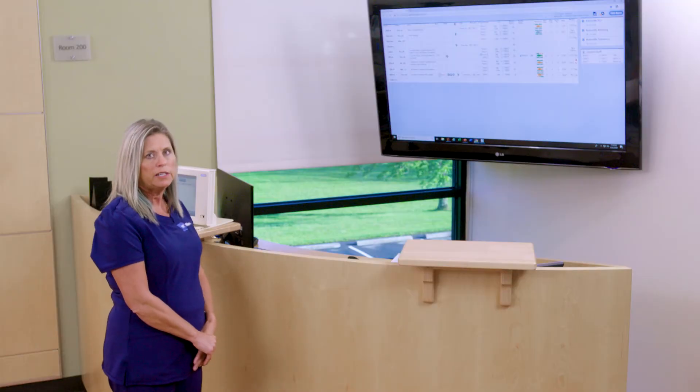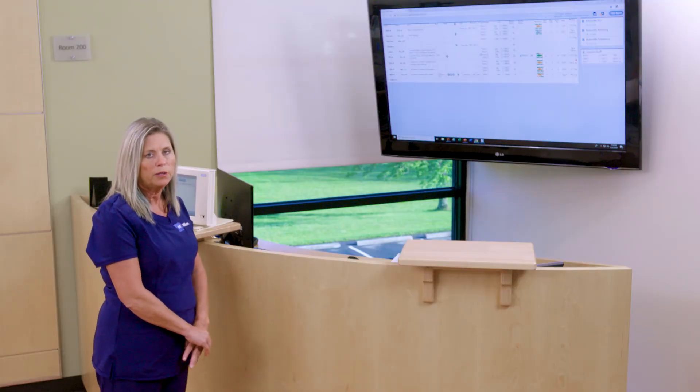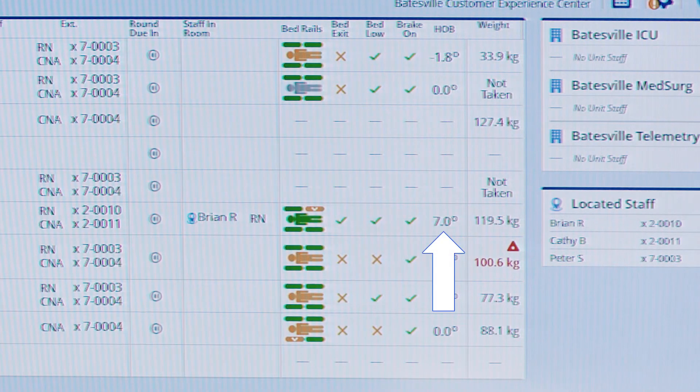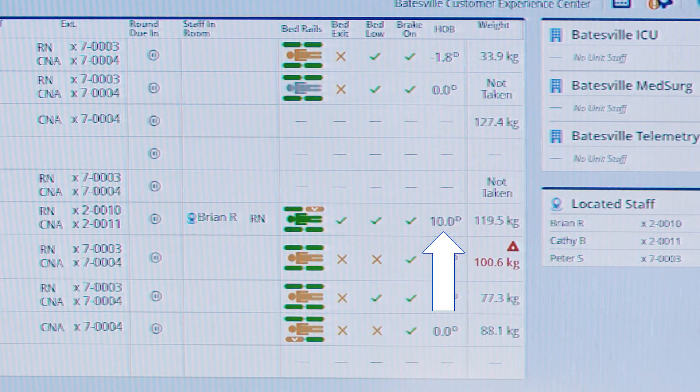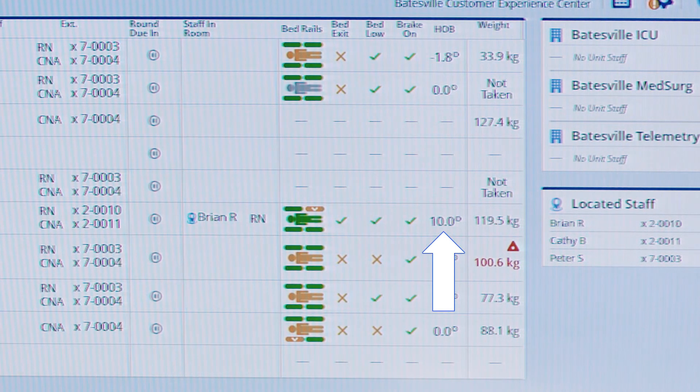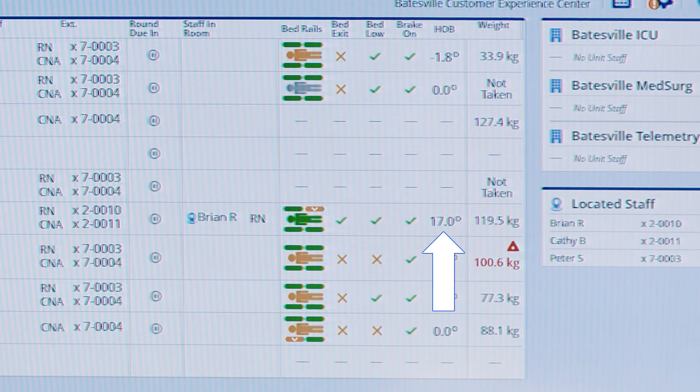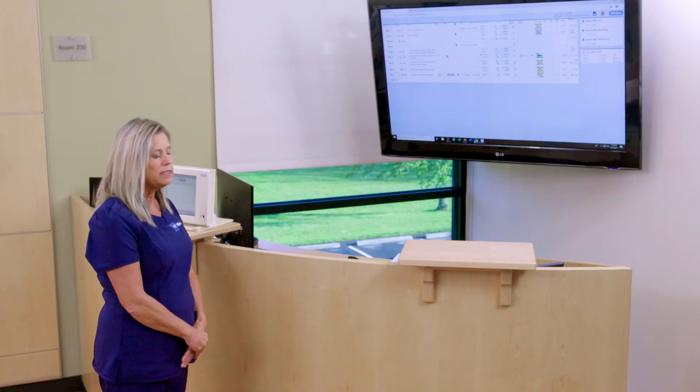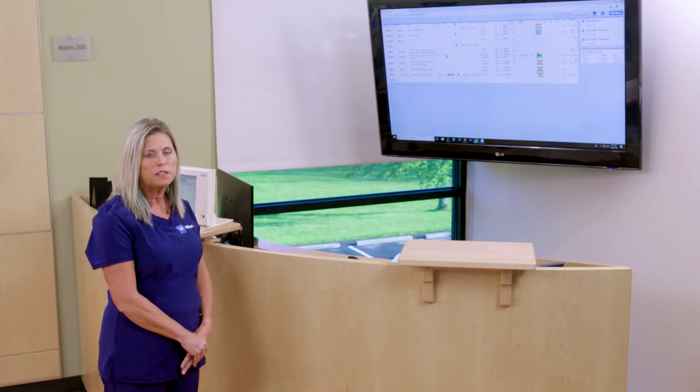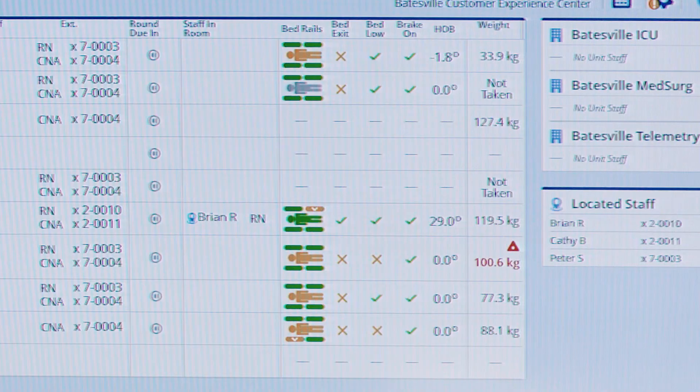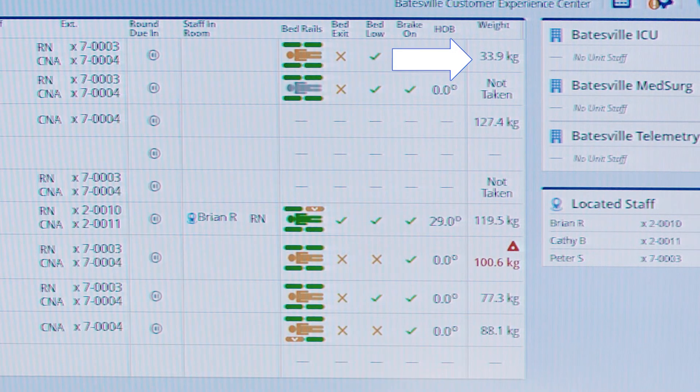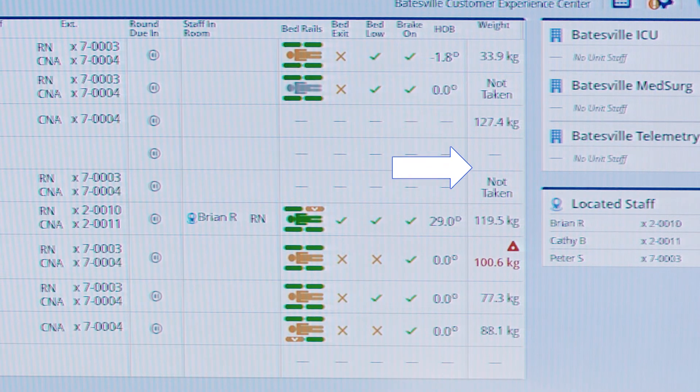The next indicator is the head of bed location. When the patient's repositioning head of bed, we can see that in real time. The next indicator is the patient weight. Once the patient's weight is obtained, it can be visible on the status board as well.